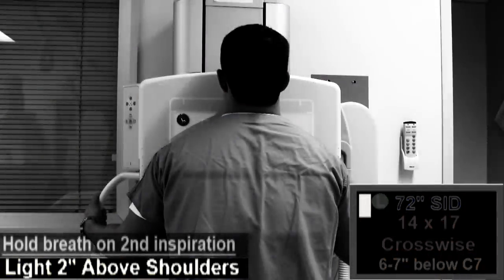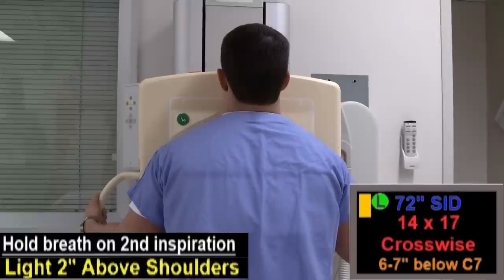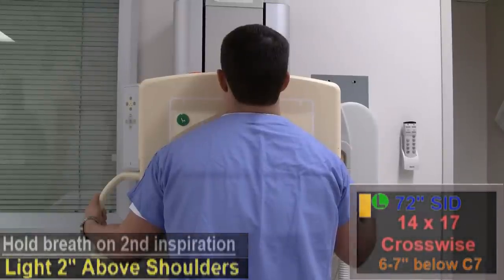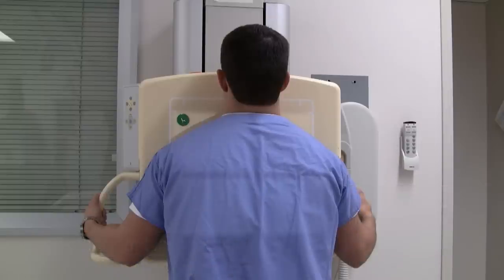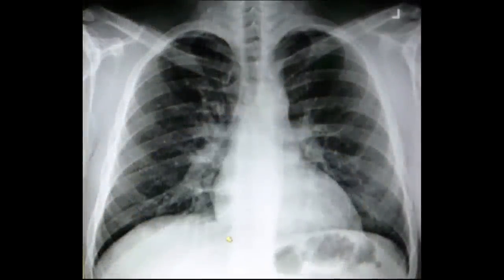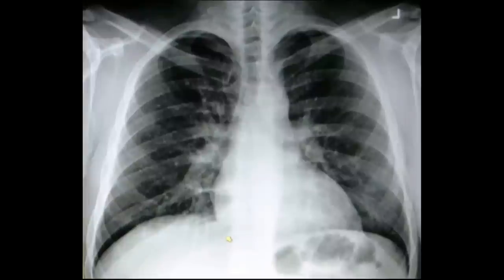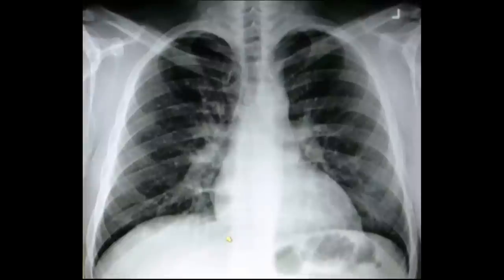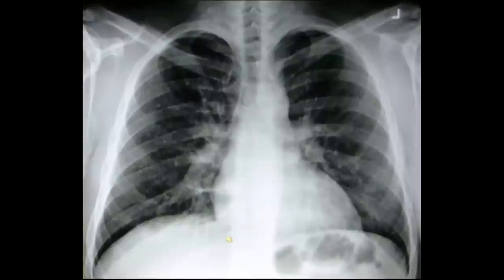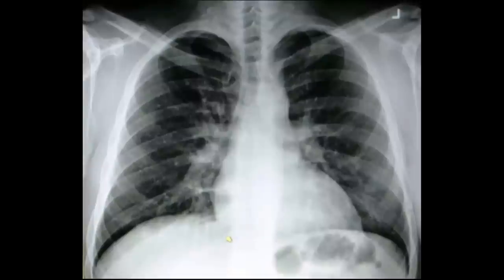Exposure is made at the end of the second full inspiration. The resulting radiograph should include both lungs from the apices to the costophrenic angles. It should demonstrate hilar markings, the heart shadow and great vessels, as well as the bony thorax. The patient should not be rotated and should be in the true PA position, with both SC joints being equal distance from the center of the spine.